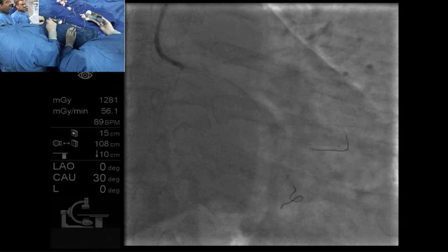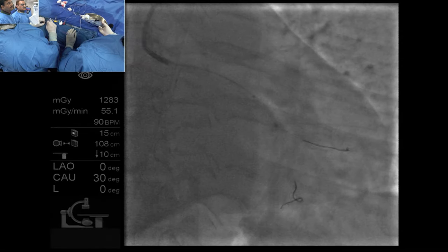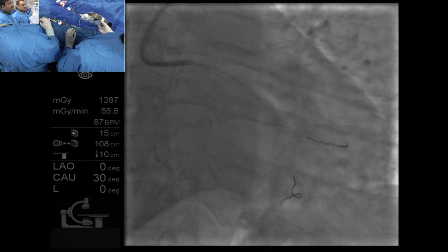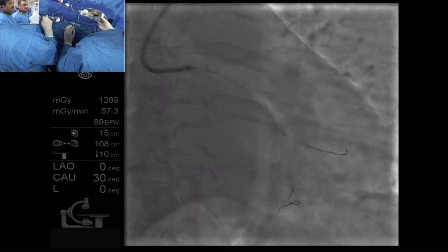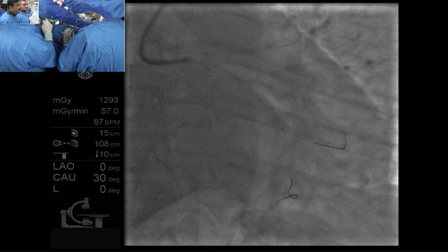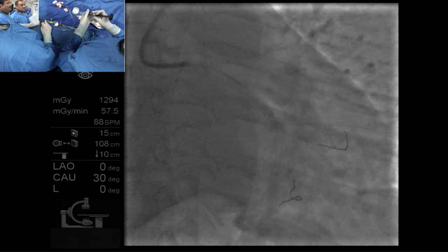Yeah, you could even take it off the bigger balloon and put it on a smaller balloon. You could do it, but let's see. I think it's letting you in, Tejan. Yeah, you're lucky. It went in. It's going. Constant pressure technique will work here. Go on. Okay. Go on. There we go.